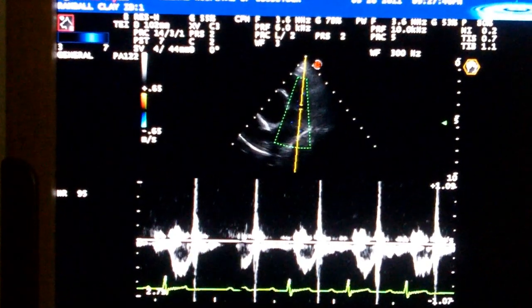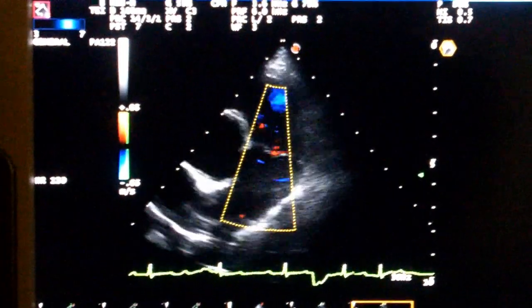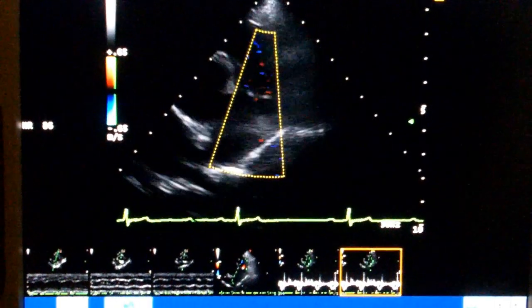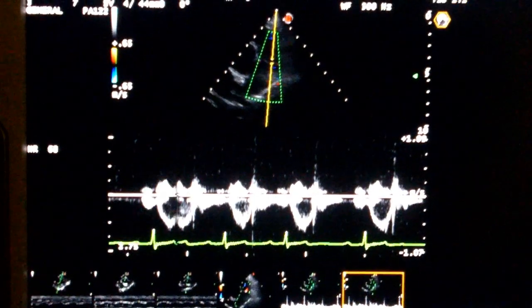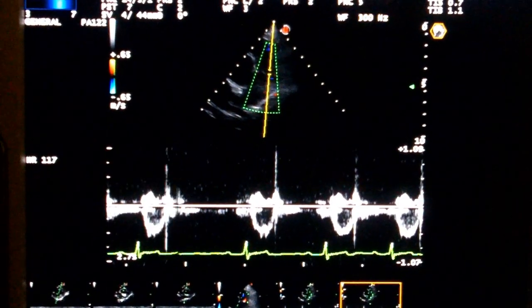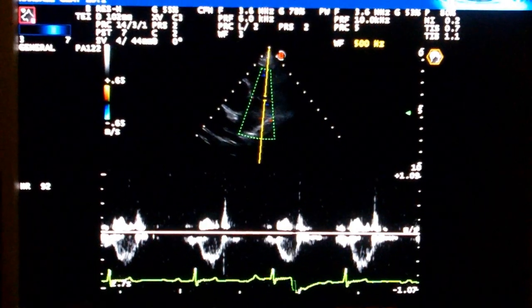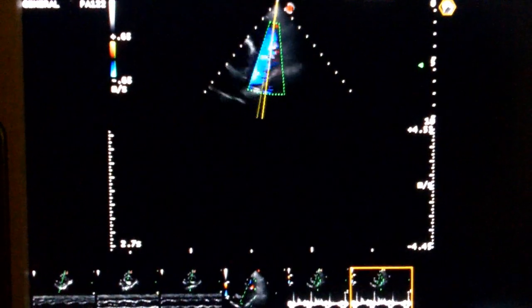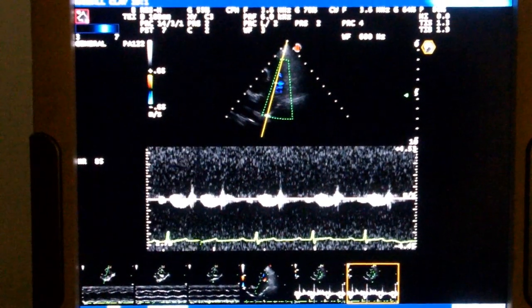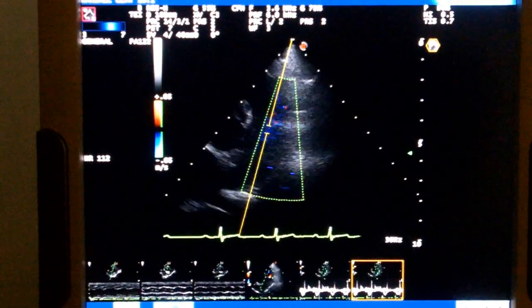You can hear the spray. If you wanted to avoid that click of the valve — those white spikes — what you need to do is increase the filters. Let's do that. Increase it — see what the filter does. It is better. You're taking out some of the valve noise. Exactly. It is a cleaner signal and you can increase it. What it's going to do is cut the low frequencies close to the baseline, so you will cut the click of the valve. And it works for continuous wave as well — continuous wave is more prone to noise, so it is set higher to avoid noise. Yeah, that's a better signal.